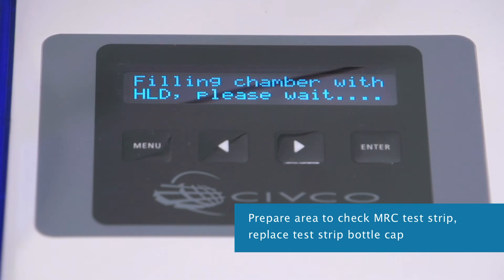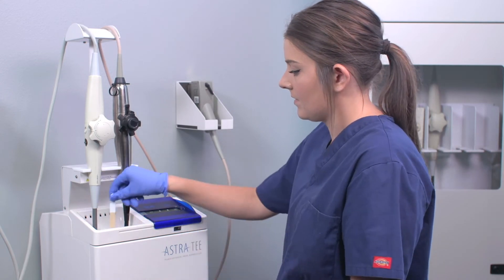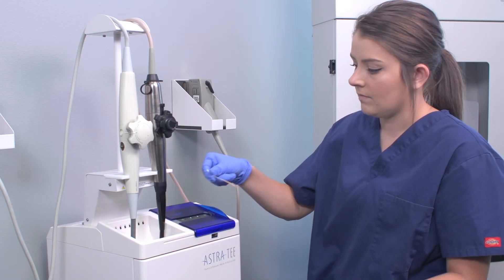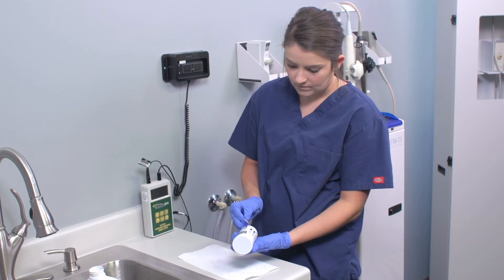When the level is reached, the display reads 'Test MRC — Pass or Fail.' Open the top sliding door and, using a gloved hand, dip the test strip into the disinfectant and hold for the time specified on the test strip bottle. Remove the strip, close the door, and touch the edge of the strip onto the paper towel. Wait for the time specified on the test strip bottle.